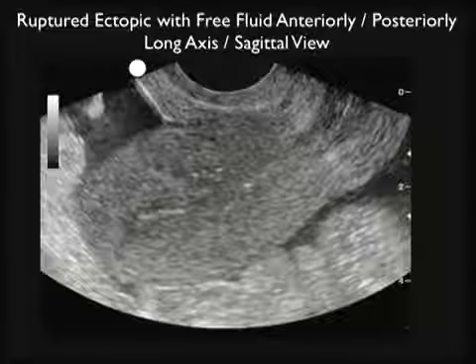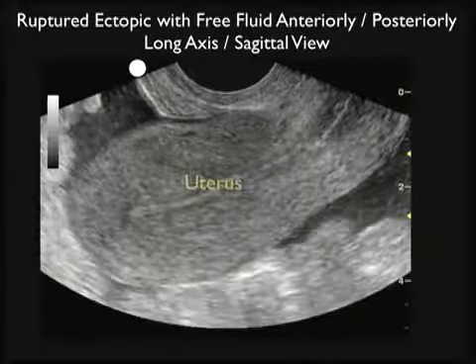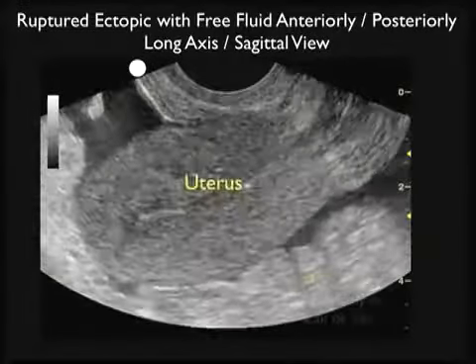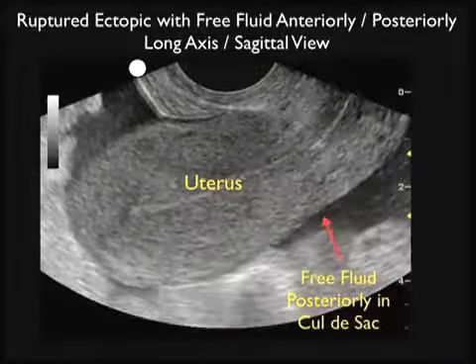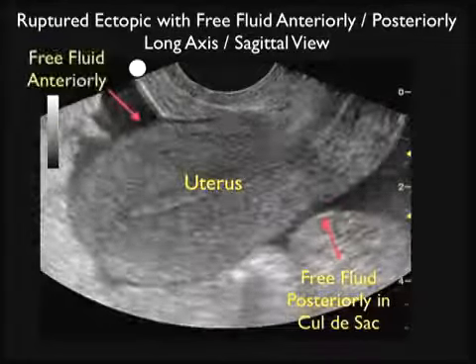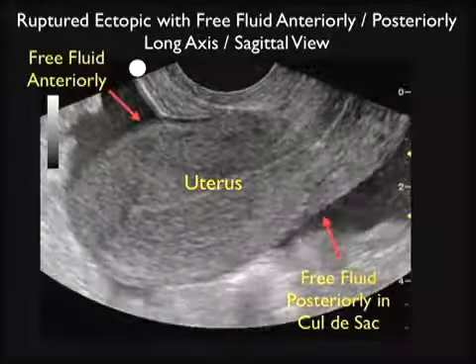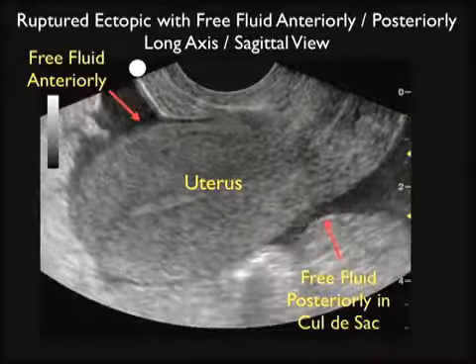Here's another patient who had a ruptured ectopic pregnancy. What we see here is the uterus again in a long axis or sagittal plane. Notice the large amount of free fluid tracking both posteriorly in the pelvic cul-de-sac and flowing anteriorly there around the dome of the uterus to lie to the top portion of the ultrasound image. So a large amount of free fluid in another patient who had a ruptured ectopic pregnancy.